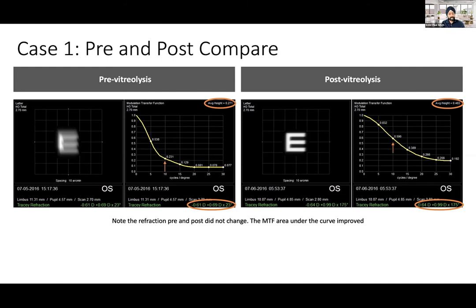And this is what the patient was telling me. Doc, you know what? I can't read as well. I feel like I need more light, and I have a hard time driving, it's not as clear. But the patient was 20/20. Did not have significant glare testing that decreased her visual acuity. So this is why we're now seeing objectively that we can quantify the amount.